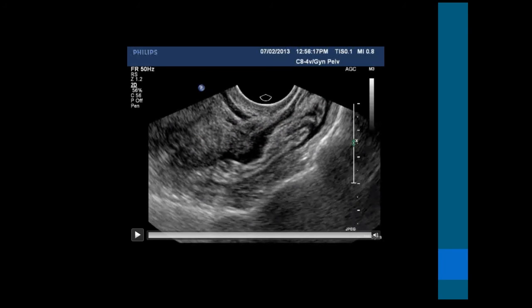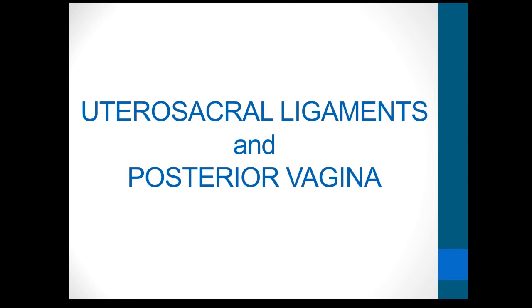So it's important not to just look in the midline for sliding, but to go to the left and to the right side, and to go behind the cervix, so that you can see that the fundus is sliding, the cervix is sliding, the vagina is sliding, and on the left and the right it's all the same thing. And otherwise describe where you see the adhesions, whether they come all the way up to the fundus or whether they're only up to the cervix, because that gives the surgeon an idea of what to expect.